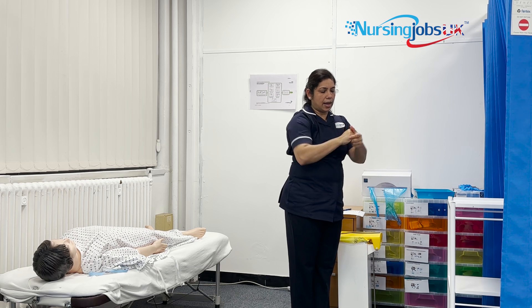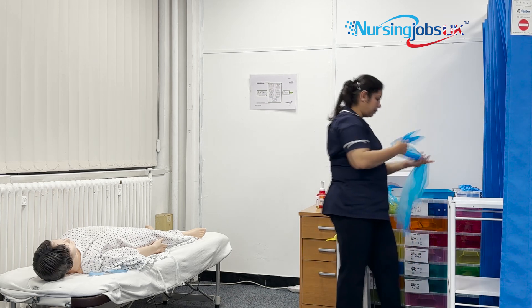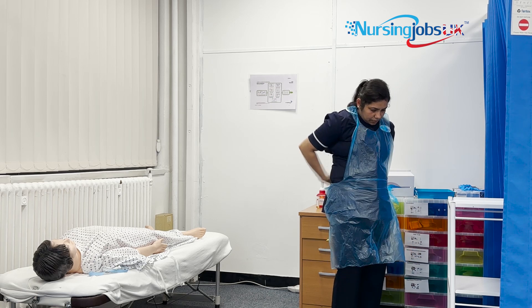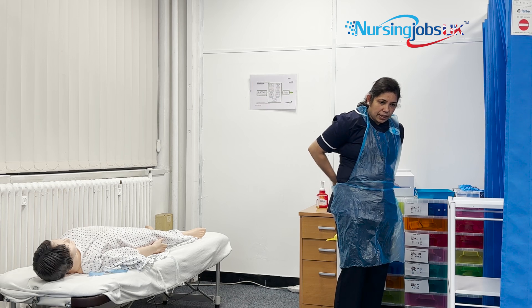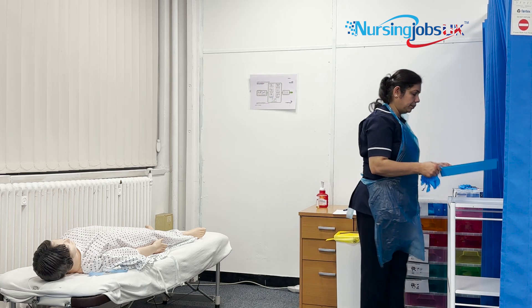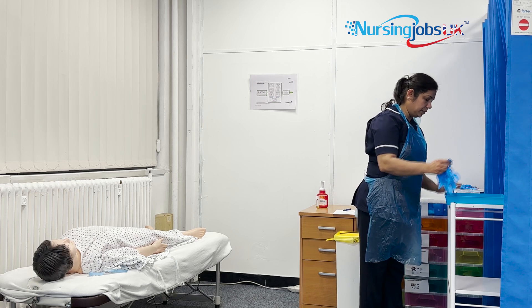I'm going to do the hand gel correctly with the full complete procedure and wait for my hands to dry, then wear the apron. When you do your hand gel, if you keep your hands slightly wet it will be easier to open your apron. Examiner, can you confirm the tray is clean from over 24 hours with soap and water? The examiner confirmed.